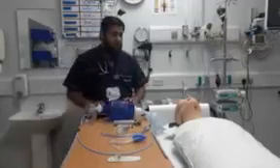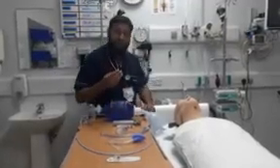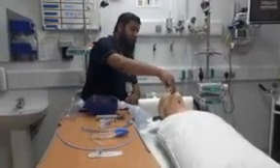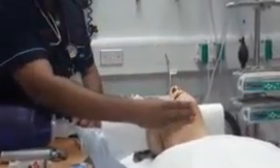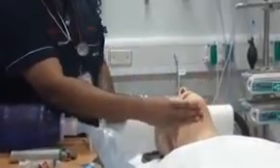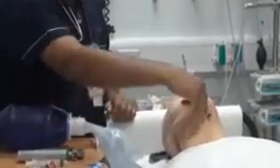I will show you on the mannequin. Three fingers between the incisors — ask the patient to open the mouth and place three fingers between the incisors. Then three fingers between the mento-hyoid region. And two fingers from the base of the floor of the mouth to the thyroid cartilage. So it's three, three, and two. This is called the 3-3-2 rule.